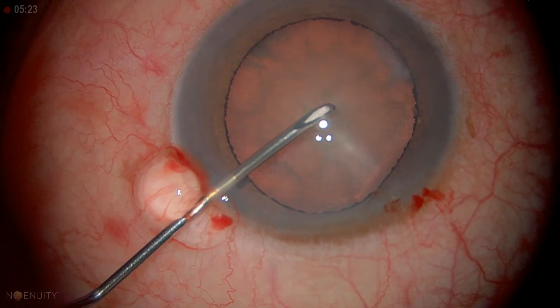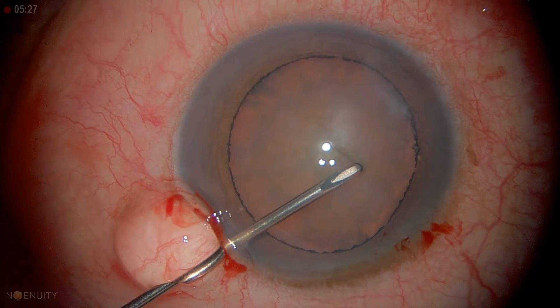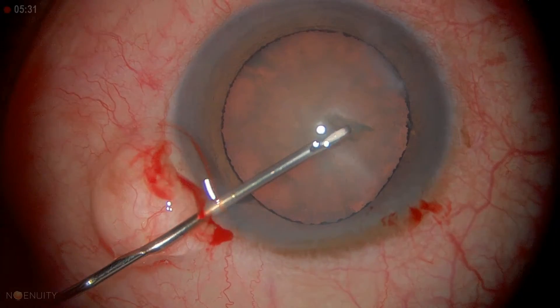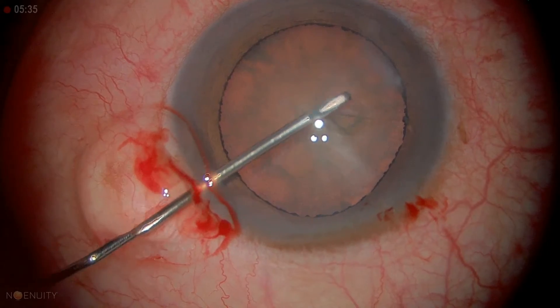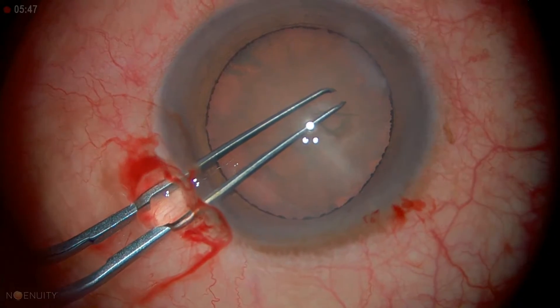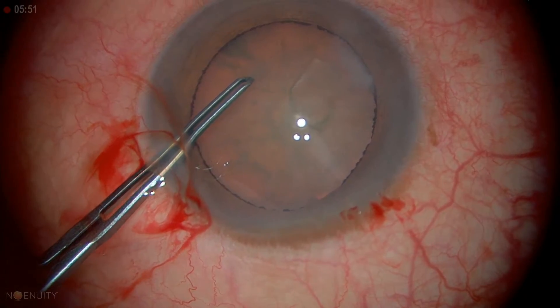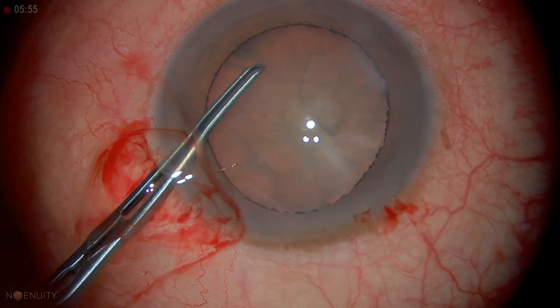Standard-size capsulorrhexis. Relatively centered — push out in a straight line, lift up, turning over that edge. We're going to use the capsulorrhexis forceps. I like to pull about two to three clock hours and let go for maximum control.